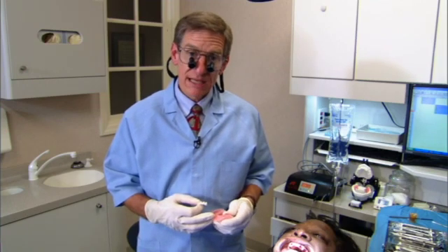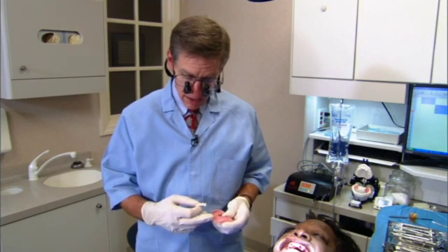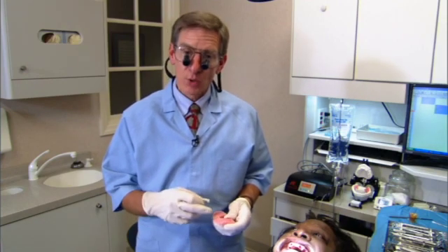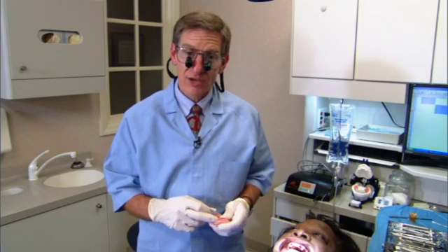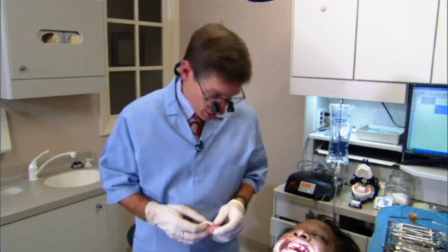What I'll do then is when she comes back for a post-op check, I'll insert her temporary partial and I'll put a little soft reline, something like Hydrocast, in that so they'll have it to wear to church on Sunday.